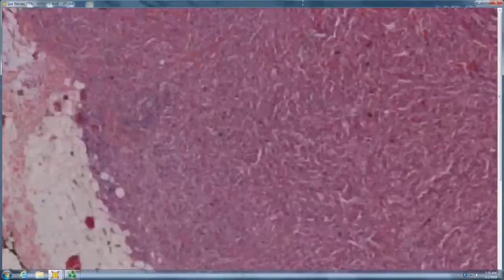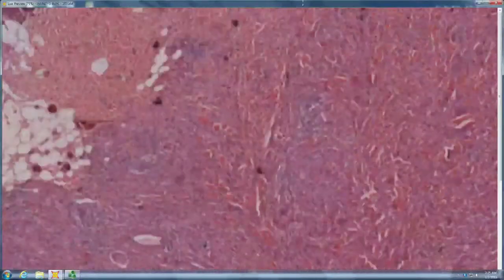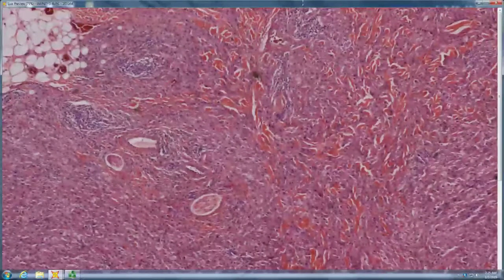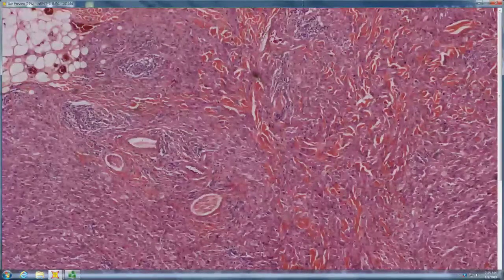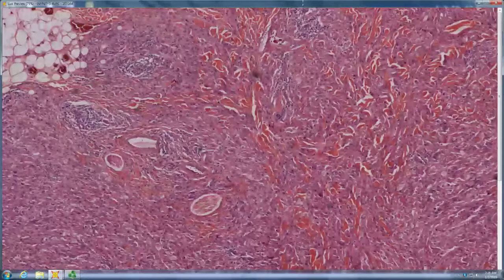Now this one has an inflammatory infiltrate that's kind of nodular, right? Suggesting the body doesn't like this one. I'd look carefully for mitoses. I'd look at proliferative fraction, because big ones you know are malignant. Smaller ones can be malignant, so I'd look for pleomorphism. I'd look for Ki67 proliferative fraction. If it has nodular lymphoid aggregates, it means there's a host immune response to it, right? Which can be a clue to a malignant granular cell tumor.